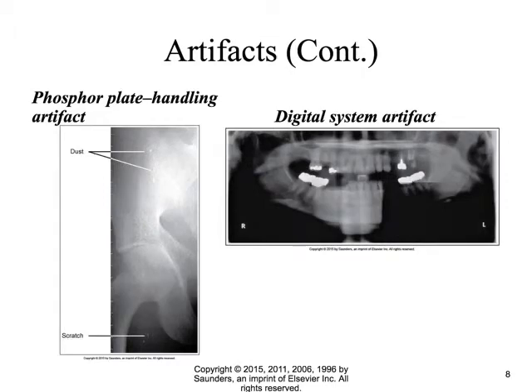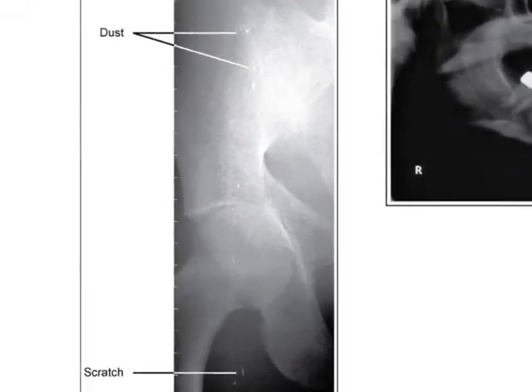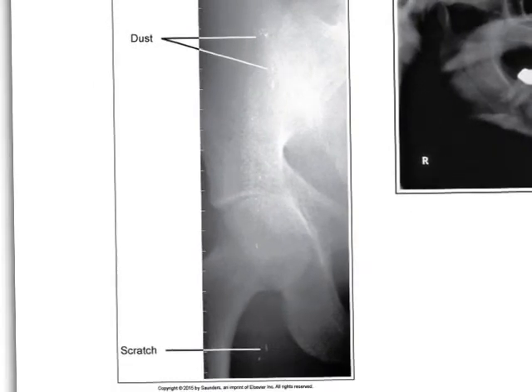All right. Here are some phosphor plate handling artifacts. Hopefully this isn't our fault, but the fault of the CR reader. If we're going skateboarding down the hospital halls on the CR plates, this is the kind of artifact we would expect to see, where the actual phosphor plate has been damaged because it's been crimped. Maybe a bed, like we took it halfway out of the bucky and then we pulled it out in a way such that it crimped the IR board, you know, and it bent it and torqued it, or pressure even. If we put the image receptor underneath a really large patient, they squashed it and pressed it together, and now we have damaged parts of the image receptor. The entire plate is now no good, right?